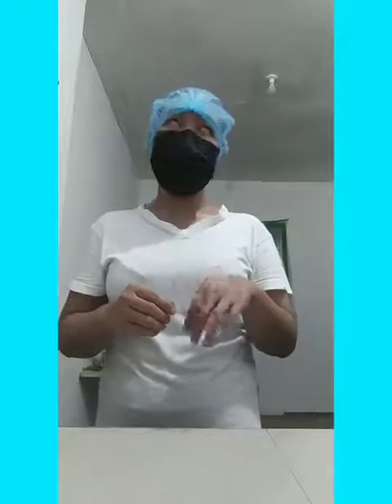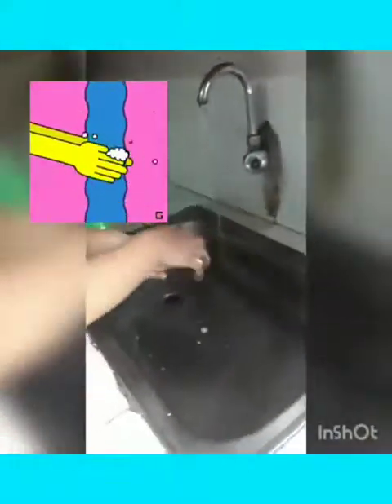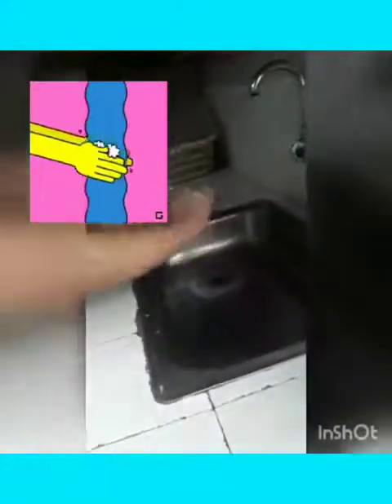For instance, if the gown does not naturally fall down and open, you can use a quick downward snapping motion to help fully open the gown and prepare for donning. Let the gown unfold, keeping the inside of the gown facing the body without touching the sterile exterior of the gown. Note, if the gown does not unfold completely, the circulating nurse may assist by pulling it down. Before donning your gown, make sure that you perform surgical hand washing.